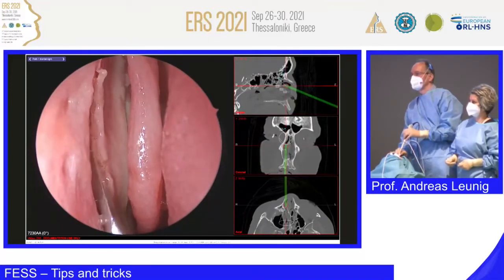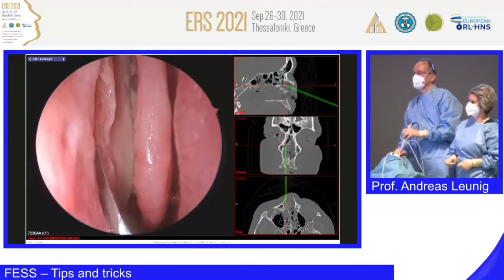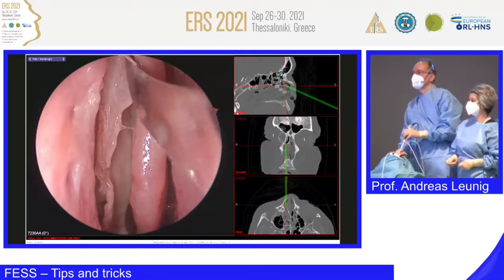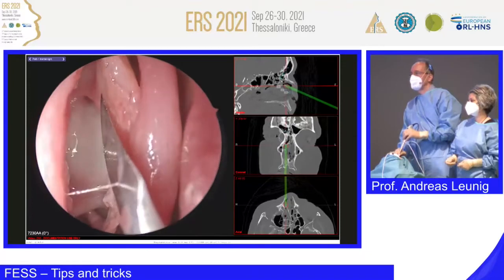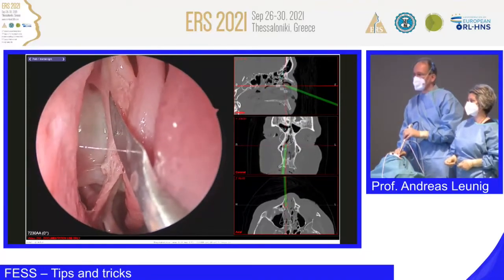Now have a look here. Can you see? This is the bone of the uncinate process and the mucosa. Now I'm opening this, and I'm looking into the infundibulum ethmoidale.